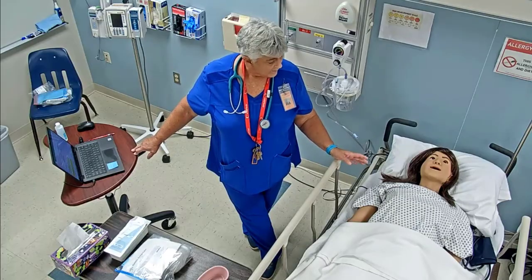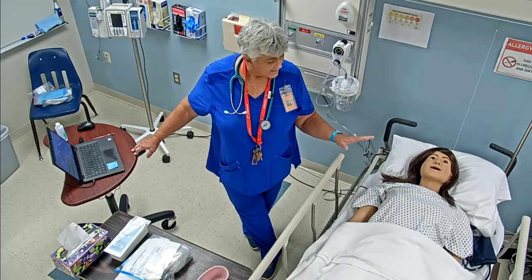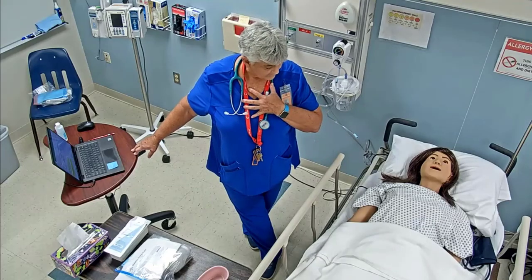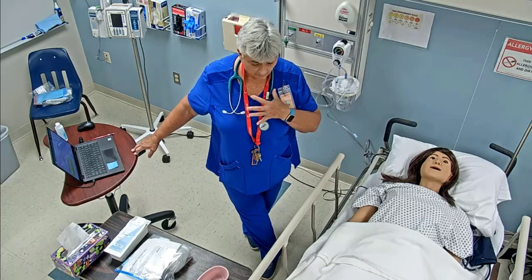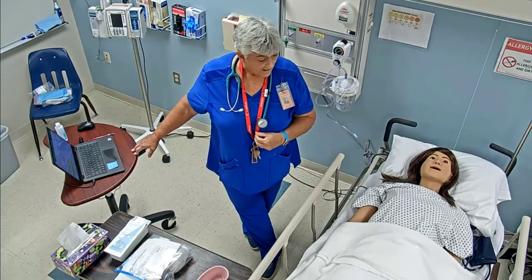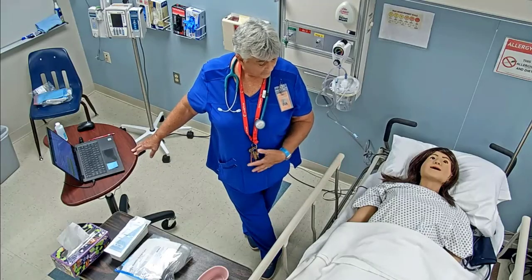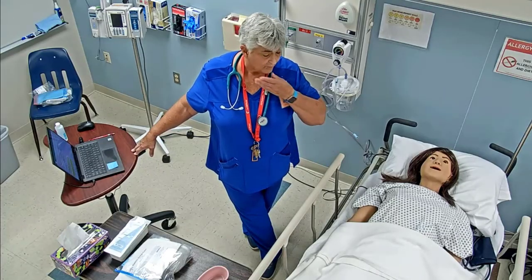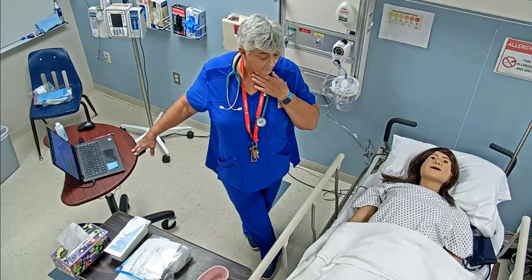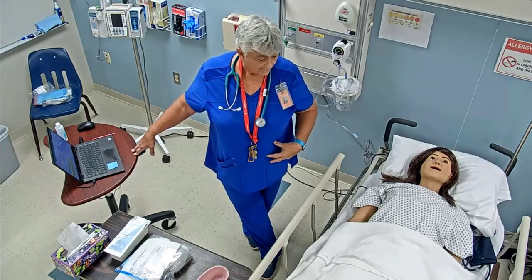I'm also going to be doing this during my procedure, looking at any kind of respiratory problems. So do they have any respiratory distress, coughing, choking, gagging, any dyspnea? That's pretty much if they have it before, but primarily during the procedure. Then I'm also going to be assessing the abdomen.